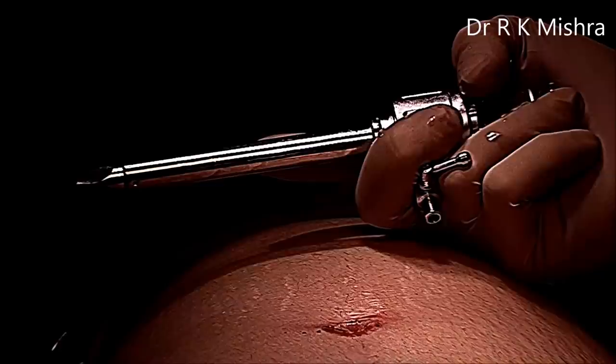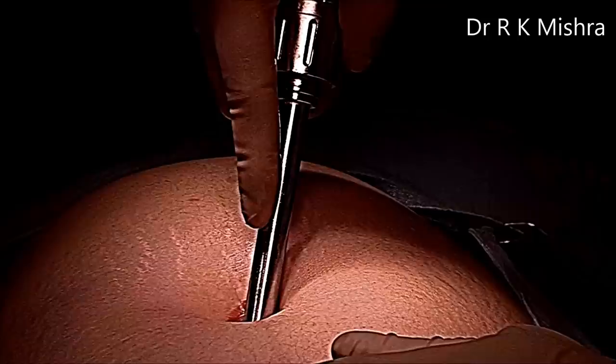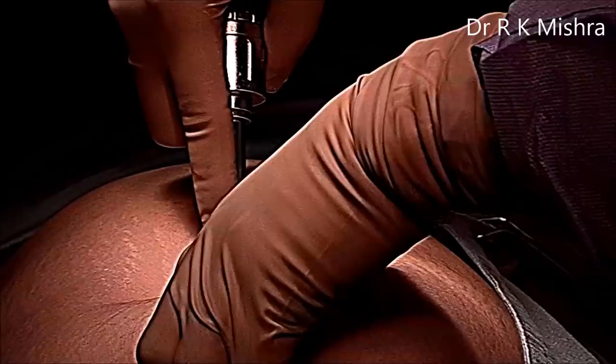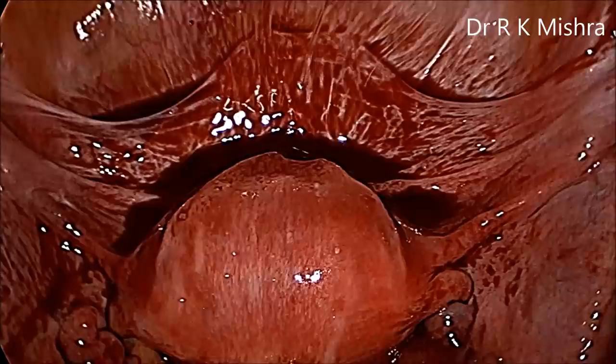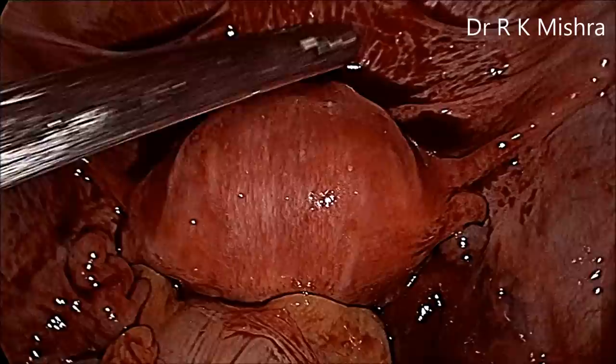The 10 mm trocar is introduced over the inferior crease of the umbilicus. The telescope is inside and we can see the blood. The patient's head is down in a steep Trendelenburg position, so a lot of blood has gone to the upper abdomen.